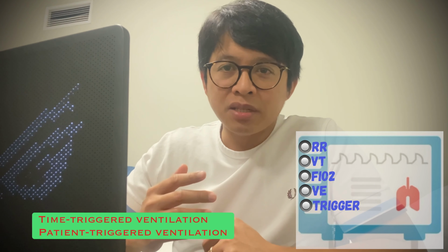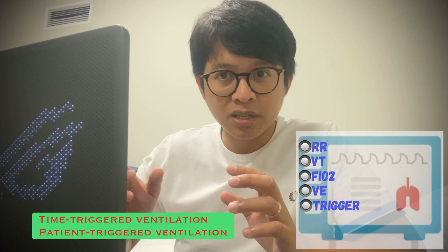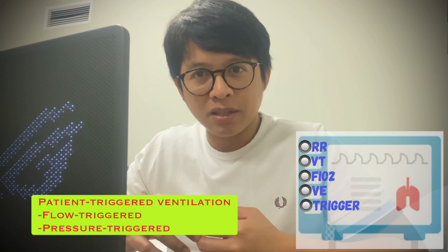And patient-triggered ventilation permits the patient to have some control over the timing of inspiration, whether it is triggered by flow or by pressure. Flow trigger is when the patient draws flow out of the bias flow from the circuit in an effort to inhale. The mechanical ventilator senses this and initiates a breath.